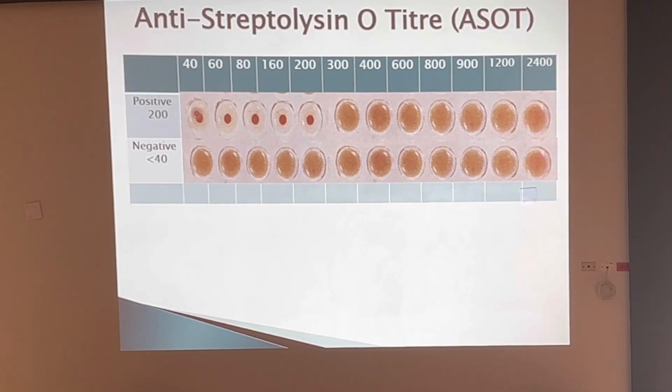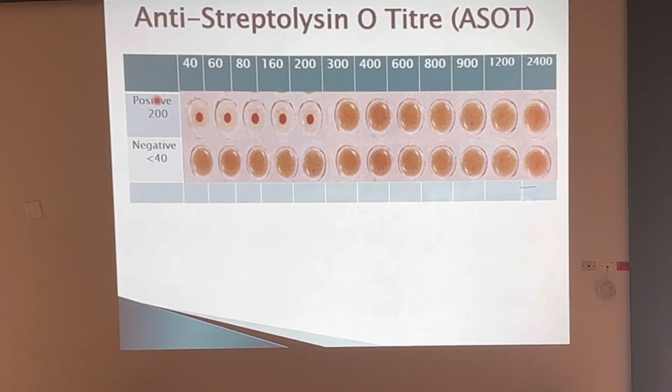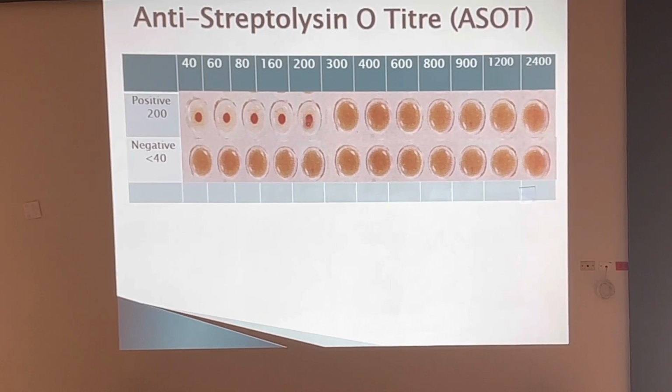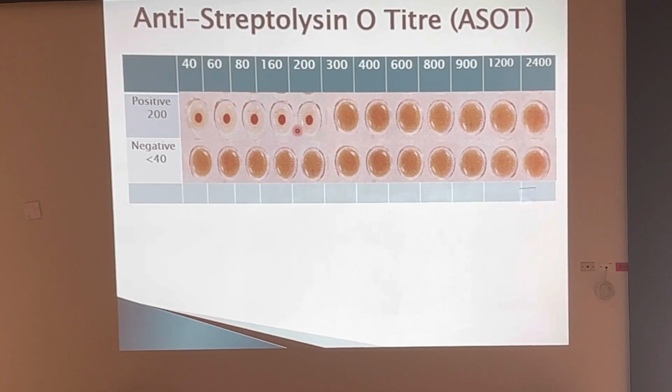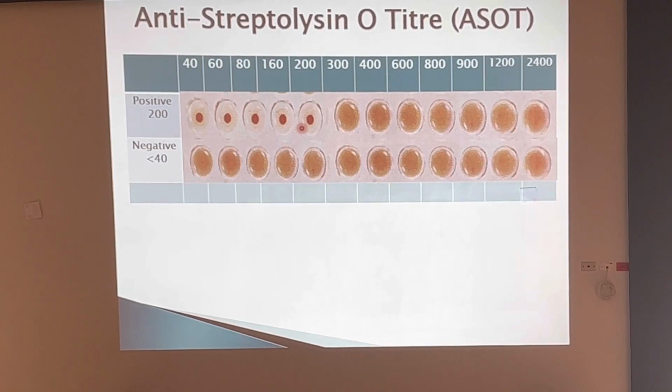That's right. So all of the first row is positive. However, the entirety of the first row of the positive row? Yeah. No, it isn't. What does this buttoning indicate? It's positive, but we're diluting, which means that you're going to have some streptolysin O that's not bound.